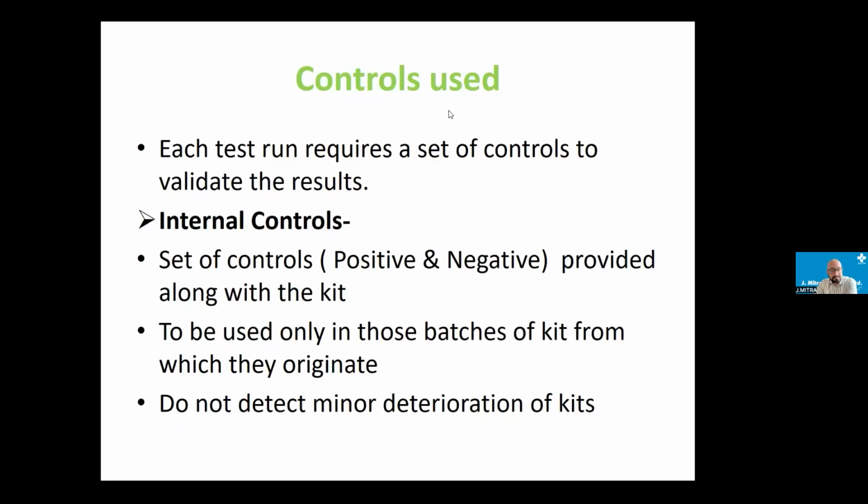Actually, we are also getting many false positive cases. And as we are fortunate enough to have NAT testing in our facility, we run the sample in parallel for NAT testing. According to literature, Western blot is the confirmatory test, but we don't have the Western blot facility in our center.